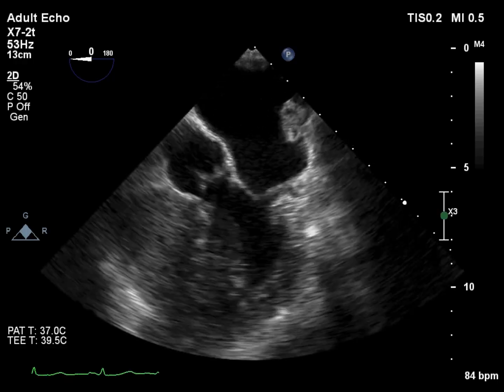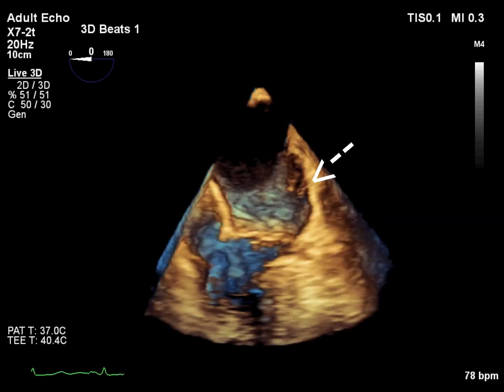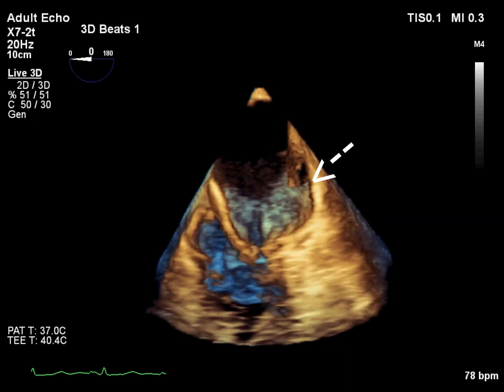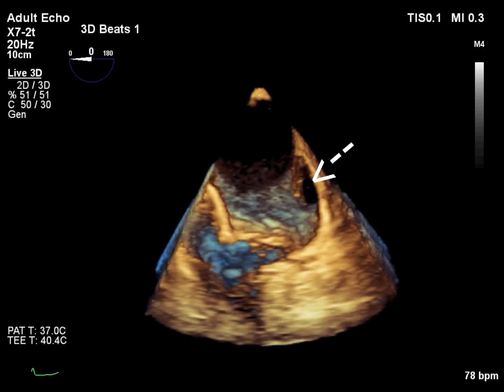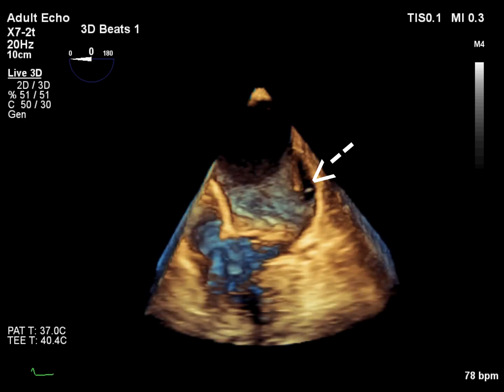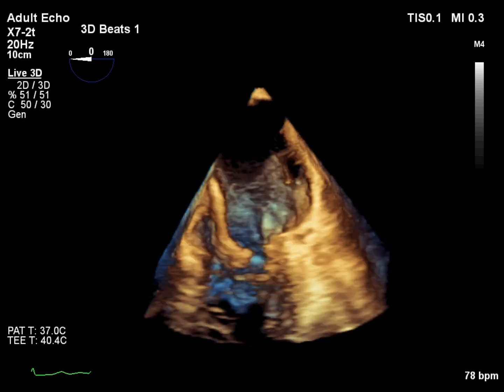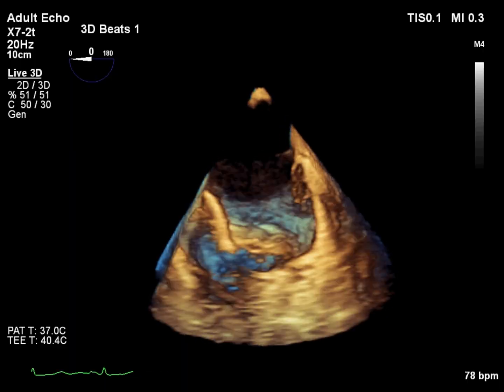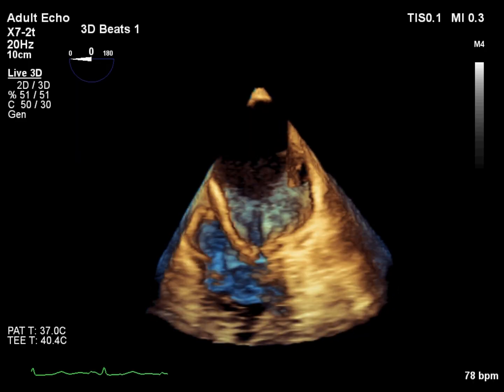This indicates an intracardiac shunt at the site of the coronary sinus, consistent with an unroofed coronary sinus. This 3D view shows the defect of the coronary sinus wall, indicating absence of the wall separating the coronary sinus from the left atrium. This condition is also known as coronary sinus type ASD. The atrial wall between the coronary sinus and left atrium is either partially or completely absent, resulting in a left-to-right shunt.